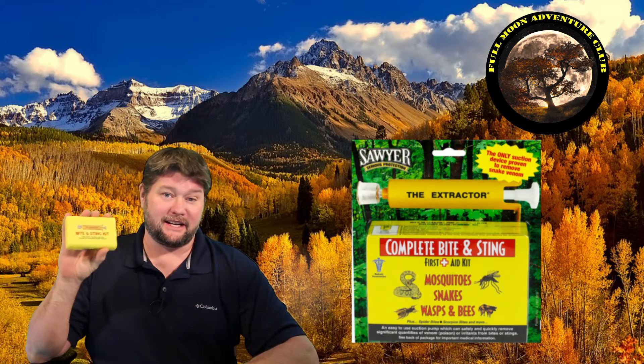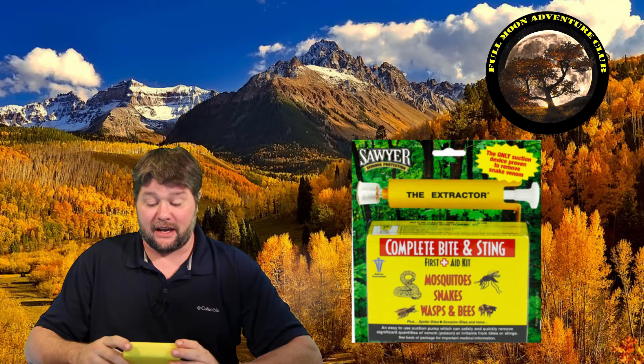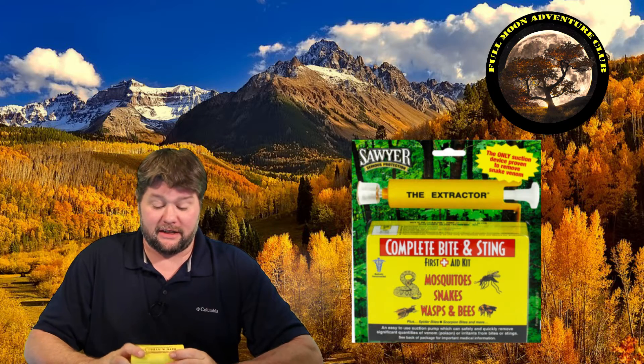Hi everybody, my name is Jim with Full Moon Adventure Club, and today we're going to be doing a review for the Sawyer Bite and Sting Kit. It's a little suction cup removal tool, but I did a lot of research on this, like I will before I do anything that I'm going to review.